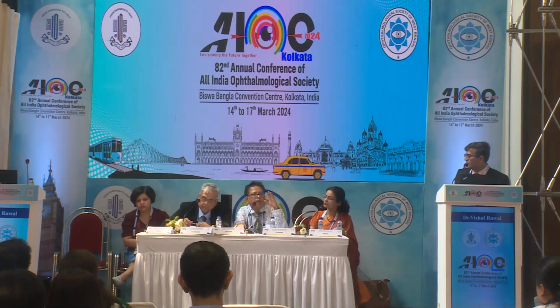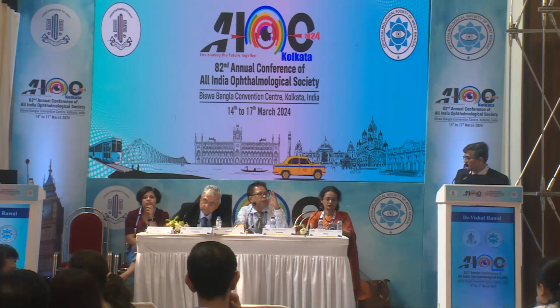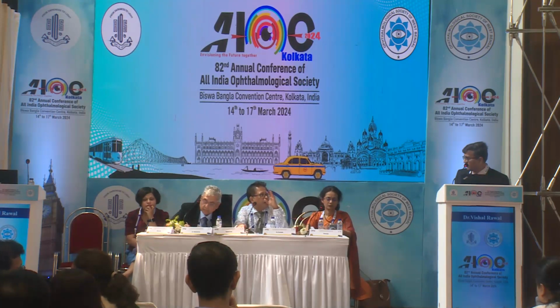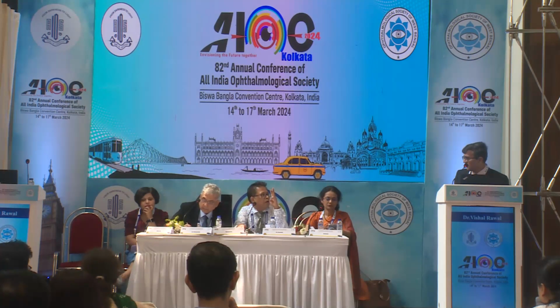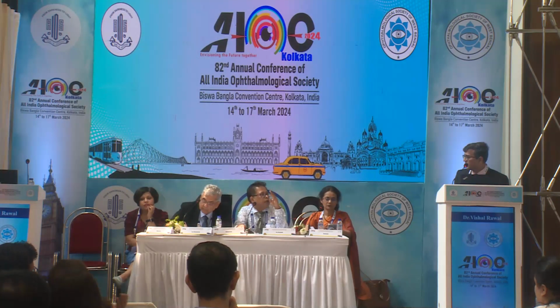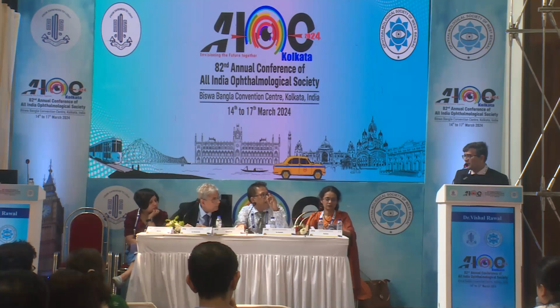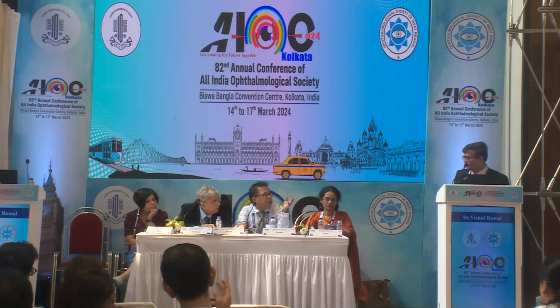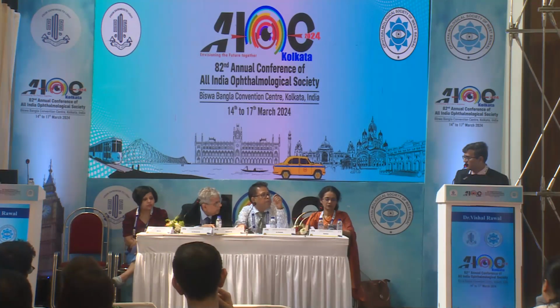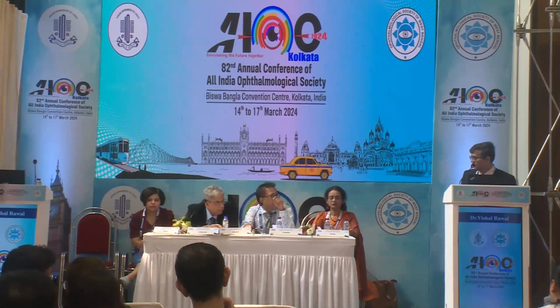Dr. Vishal, nice paper, but it's not the cell pattern which is important. If you see the pattern of vascularity in the choroidal melanoma, out of 9 vascular patterns, 3 have a worse or poor prognosis. Whether you can pick up those in the contrast analysis will be important. Secondly, you have compared choroidal melanoma with hemangioma; whether metastasis will be useful? If you want to show the point, it is the high rise versus the peak time, which would give a better result in all 3 conditions.